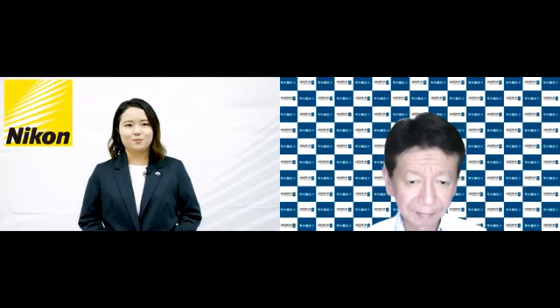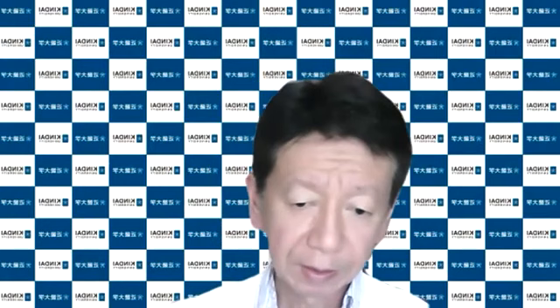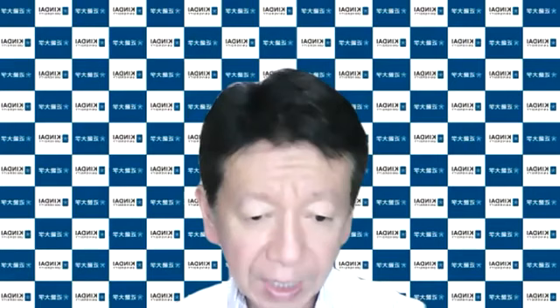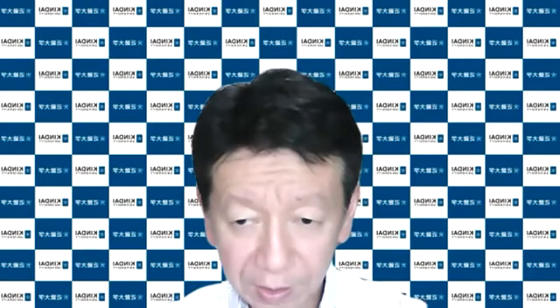Yes, the first question is, were you able to obtain OCT scans in most of the peripheral parts? And any difficult cases for peripheral scans? My answer for the first question is yes, I was. I was able to obtain OCT scans pretty easily wherever you can visualize the fundus by the ultra-widefield camera. By changing where you want to scan, the scanning is very easy.